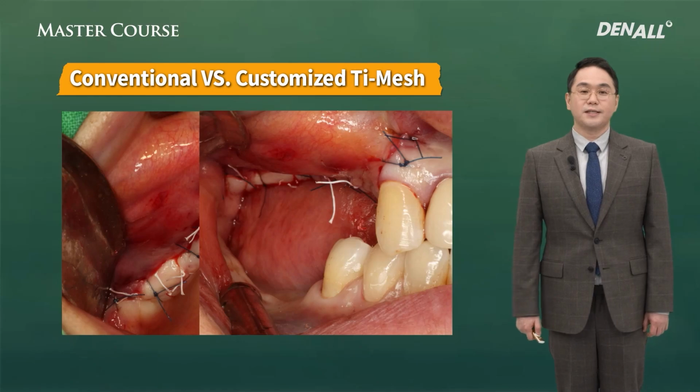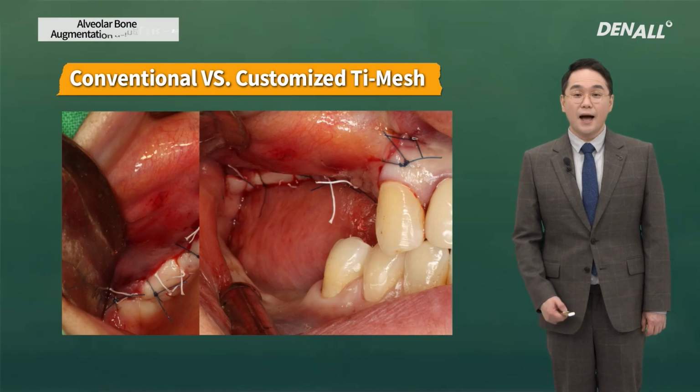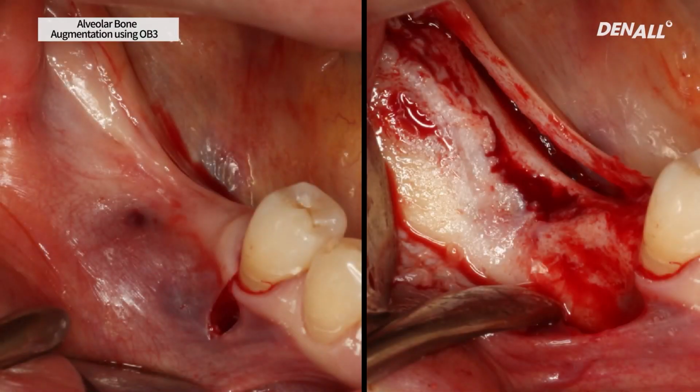After operation on maxilla lateral view, you can see vertically augmented alveolar bone. Now it's time to operate in the mandible. Two vertical incisions and a crestal incision are made, and the flap is raised. On the upper jaw, all teeth 14, 15, and 16 except 17 had a big vertical bone deficiency, and the bone quality was poor, and the distance to the sinus floor is extremely limited, hard to achieve primary stability, so it is not possible to place implants.